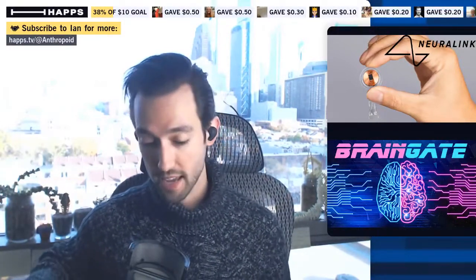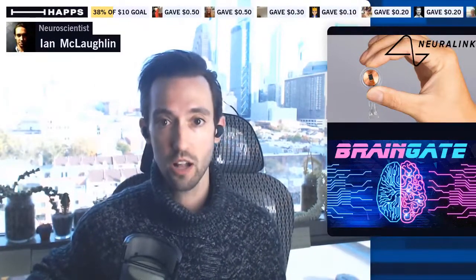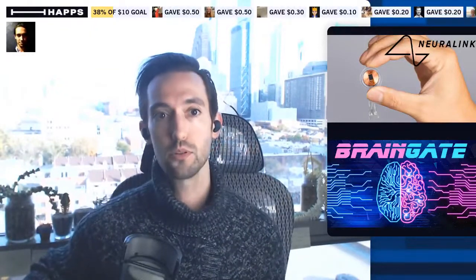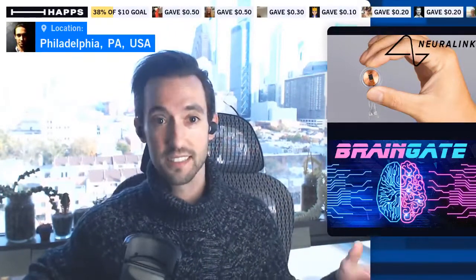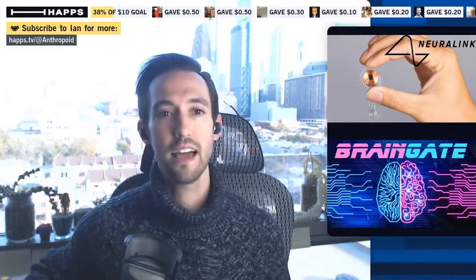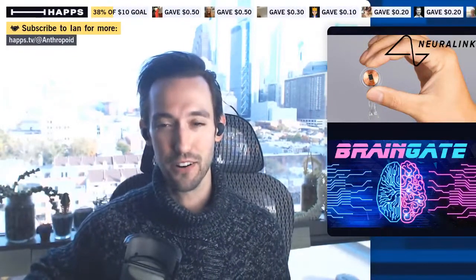BrainGate, earlier this year, which is a collaboration between scientists and physicians at Brown and Stanford universities, as well as Massachusetts General Hospital, some of the top biomedical institutions in the world, was able to both wirelessly record the activities of neurons and deliver stimulation, all wirelessly. So it's really impressive stuff. But neither Neuralink nor BrainGate had entered the realm of visual perception, easily one of the most, if not the most, complicated components of our sensorium.